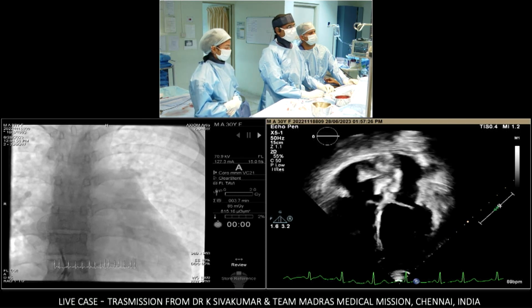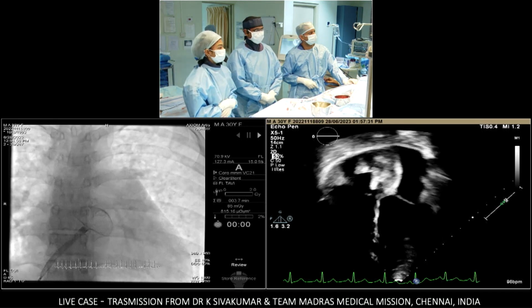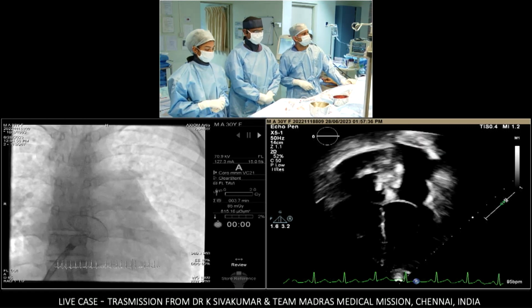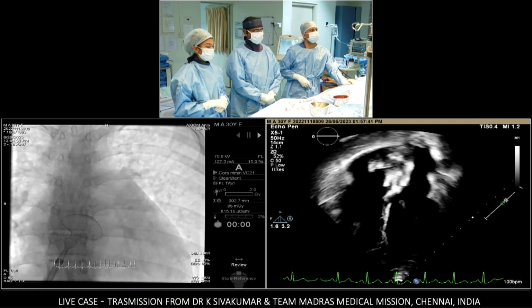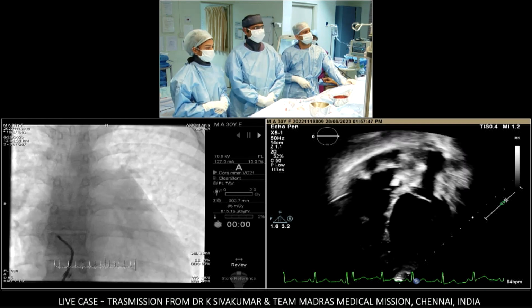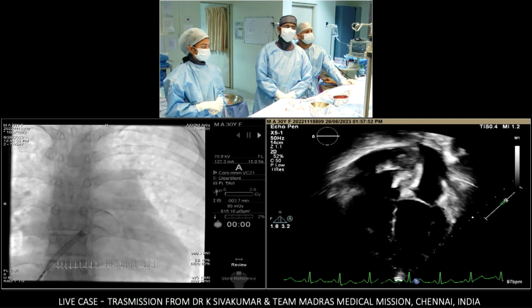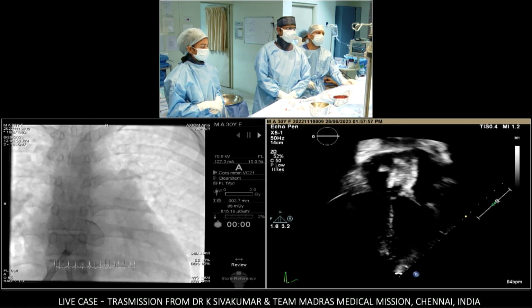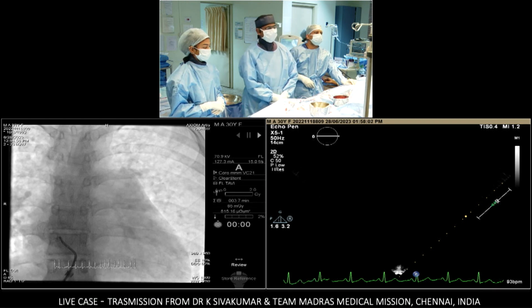Shiva, just hold on for a second. There's a question. Yeah, go ahead. Yes, I'm Amr from Cairo, Egypt. The obvious advantage of this device is that it has two waists, so it can adapt to many sizes. How do you choose which waist you will center the device on? If you center it to the left side waist, how do you recenter it to the right side? If you center it to the right side from the start, you can pull the device to jump to the left side waist, but how do you reverse it? Very important technical question, Shiva.